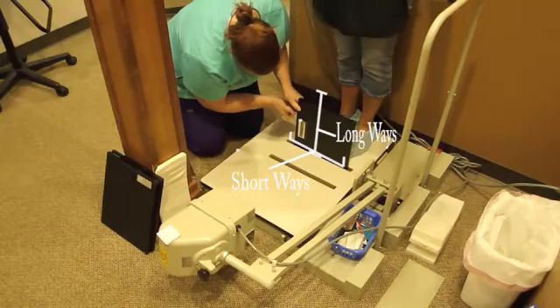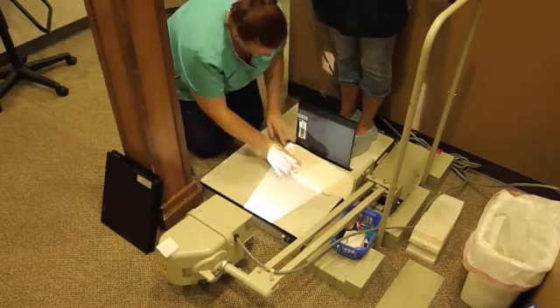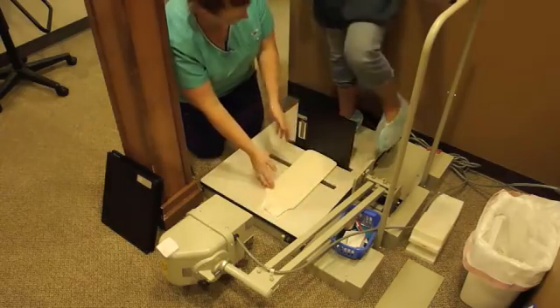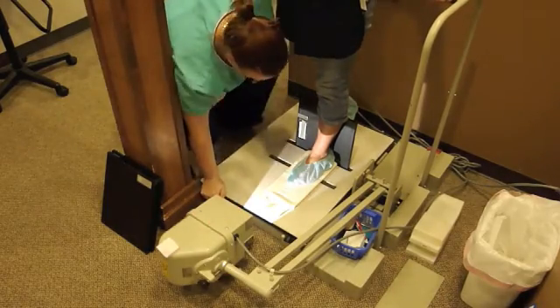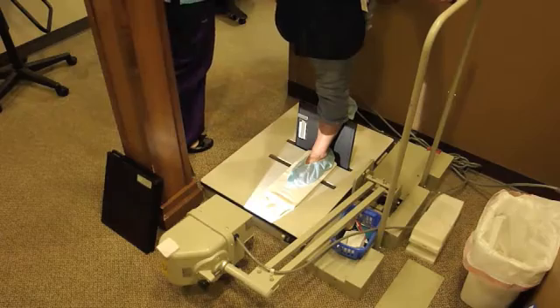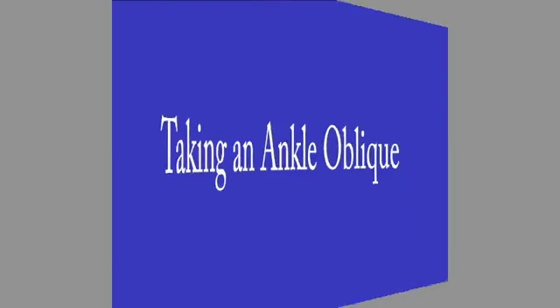To take an AP, you will have the patient stand behind the cassette and bring the foot of concern forward to the front of the cassette, while the other foot remains behind. Have them place their leg and foot in the center of the film and heel up against the film. For the AP, the toes will be facing toward you. Make sure the light of the head is encompassing the entire cassette and the black dot is in the center of the ankle. You may need to adjust the neck. Set your pulses for 0, 1, 0 and take the X-ray.